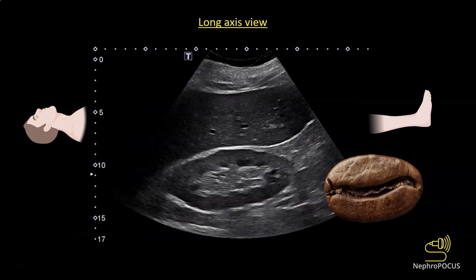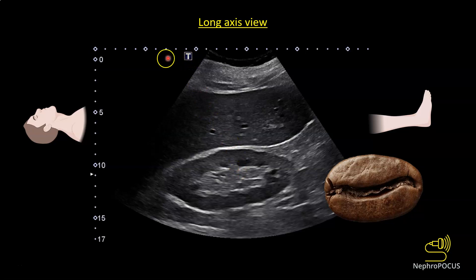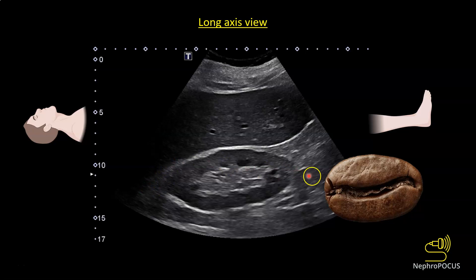This is how the long axis view of the kidney looks. Kidney is a bean-shaped organ. It is well defined because of the presence of a capsule, and we are looking at the right kidney through the liver. Liver is on the top of the image and kidney is at the bottom. The probe orientation marker is towards the patient's head, so this part of the image is superior and this part is inferior.